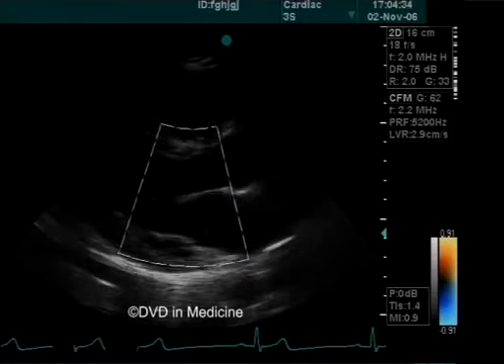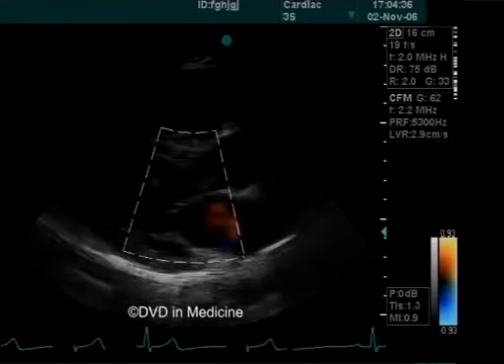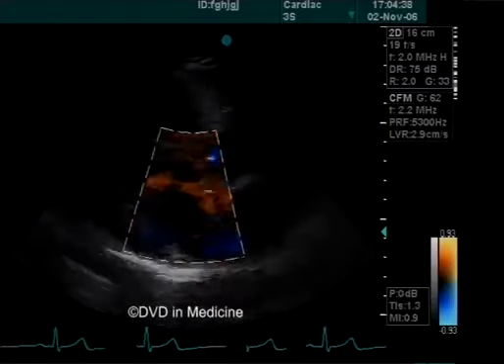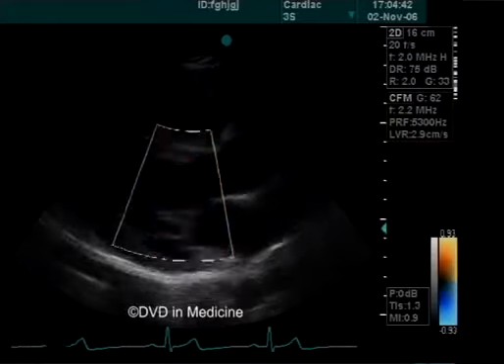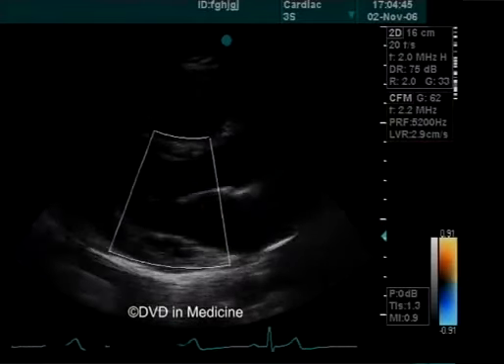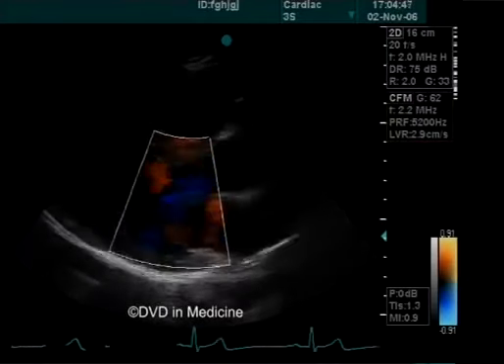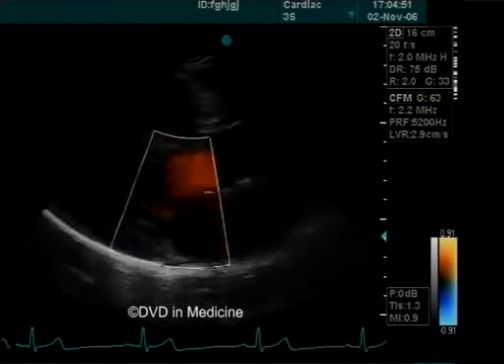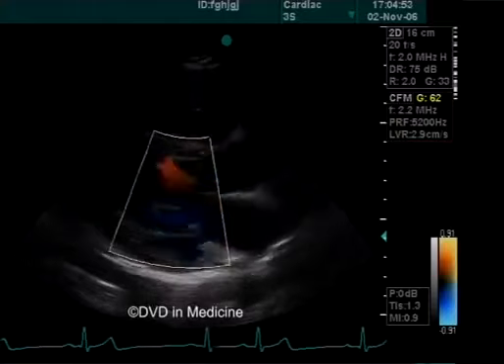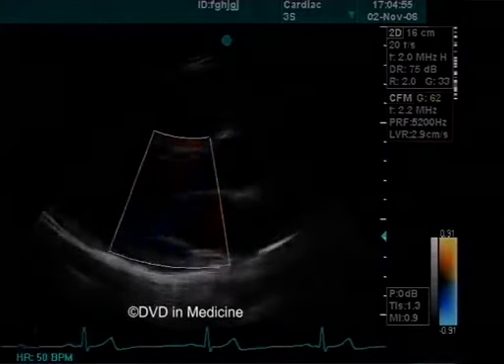At this stage, one may start color flow Doppler imaging. One chooses the right size of the color Doppler sector and places it in a two-dimensional image, so the sector captures the mitral and aortic valves and the upper part of the interventricular septum. In the limits of this sector, one can assess the type and velocity of blood flow.